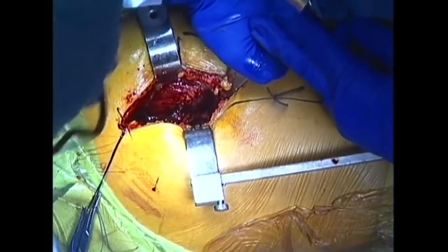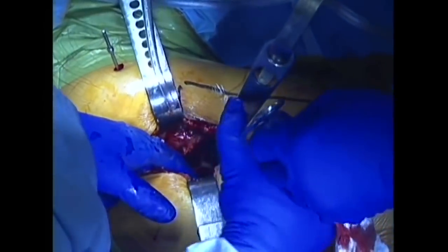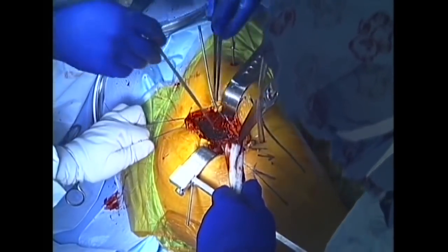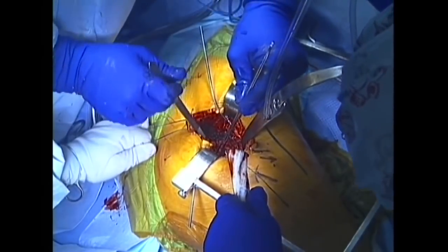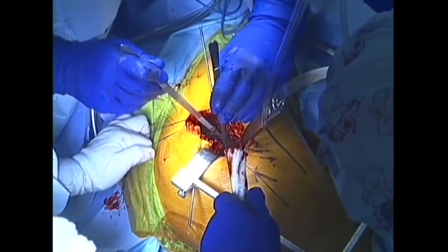Retractors are now placed around the pelvis to expose the acetabulum, or hip socket. The cartilage rim around the socket is called the labrum, and this is carefully removed.